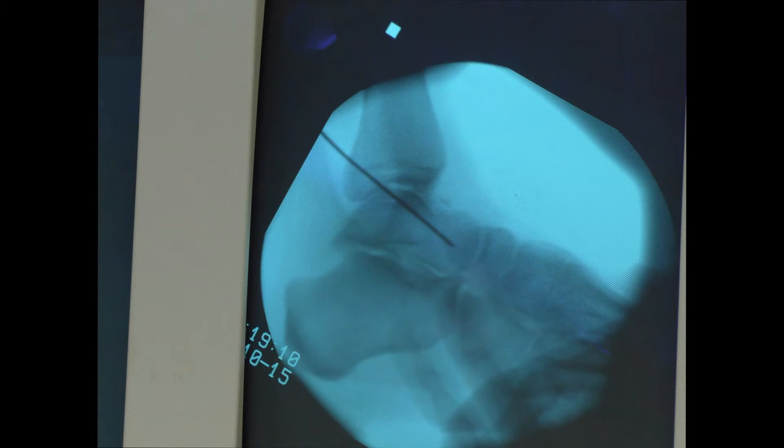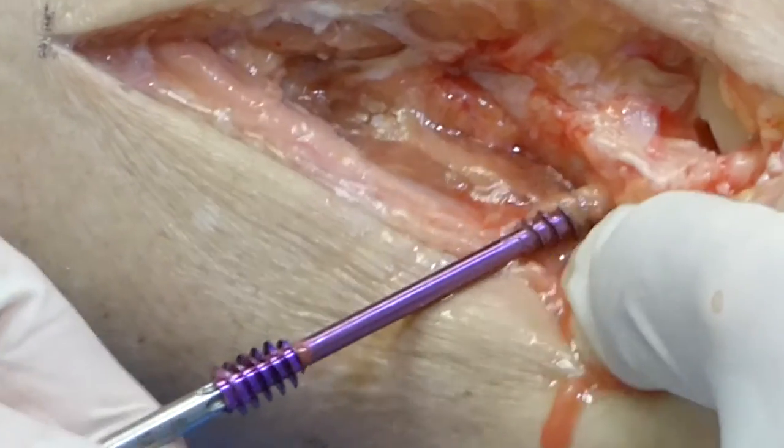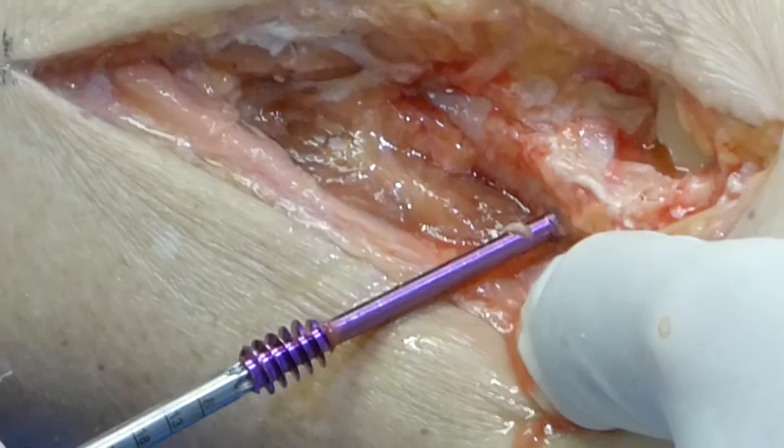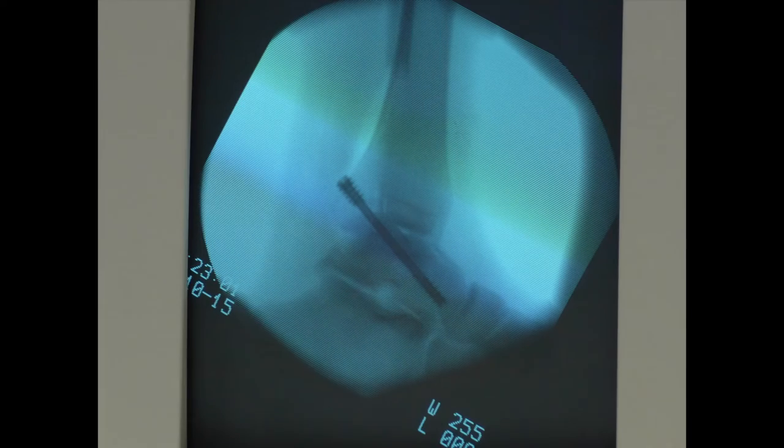Confirm the wire position on fluoroscopy in two planes. After measuring and drilling, the home run screw is inserted to compress the joint. Fluoroscopy should be used to check the position of the screw, and clinically check the position of the arthrodesis.